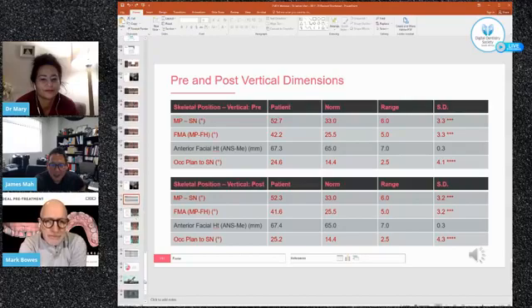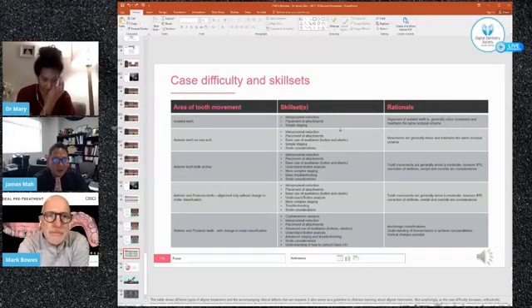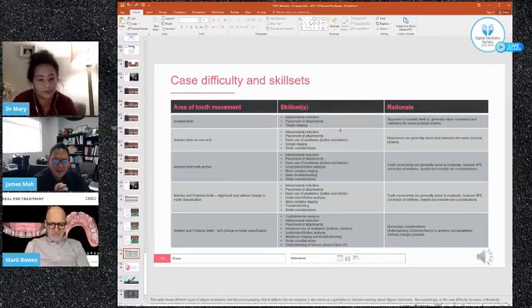So those are the cases I'd like to show, and I'd like to summarize just quickly 2 slides, and then I'll shut up. So when we're getting into it, it's really important to look at this. I know it's a busy slide, but as people progress on their own individual aligner journey, it's important to know, if I look at the middle column, as you get into more areas of tooth movement, you're going to have some accompanying skill sets. So originally, if you look at simple teeth, you just need the ability to place attachments and interproximal reduction.